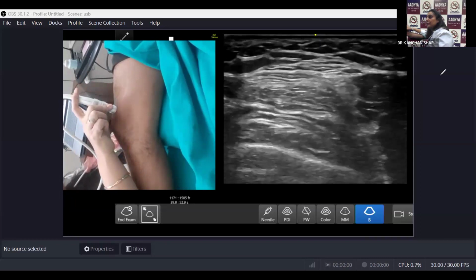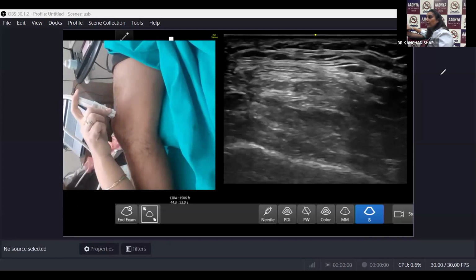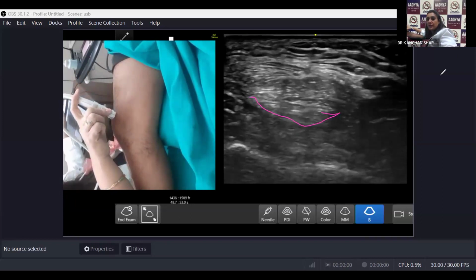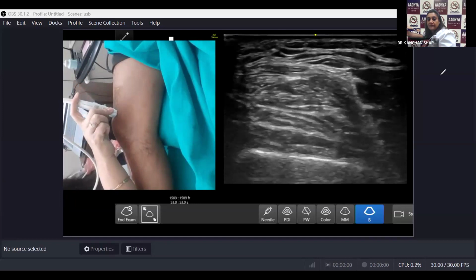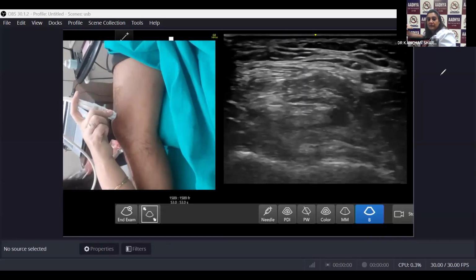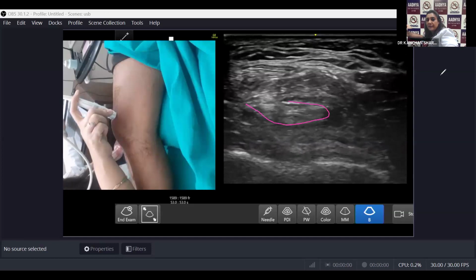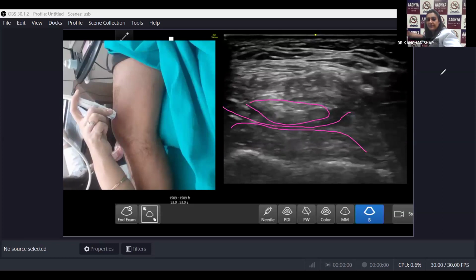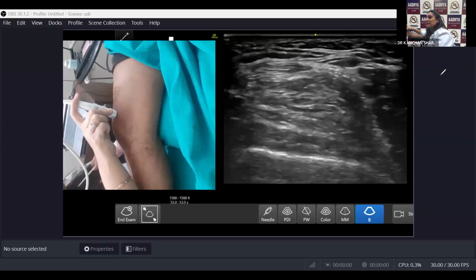And I will show you the fat pad. Okay. So now concentrate on this structure, okay? This will go off if I go up. Gone? It will come back. It has come. So if this is my suprapatellar fat pad, this is my prefemoral, this should be the recess. Right?